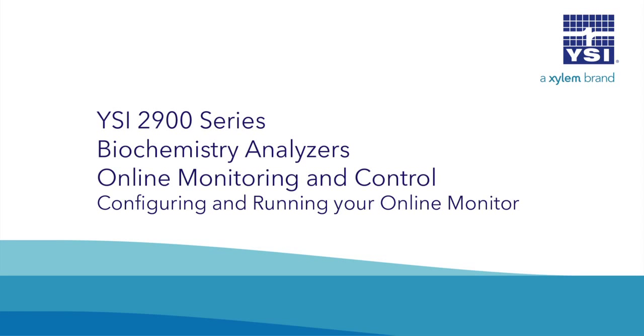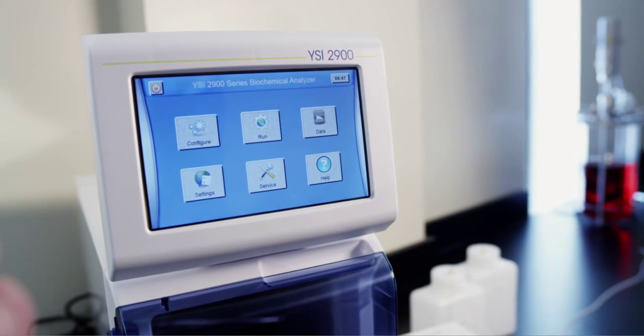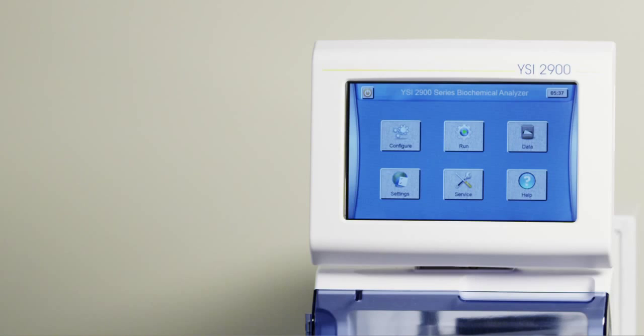YSI 2900 series biochemistry analyzers. Configuring your online monitor and control session. Configure the instrument with the necessary membranes, reagents, and buffers as described in other YSI videos.